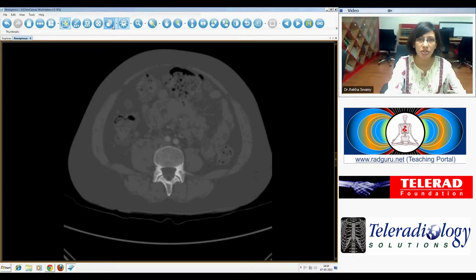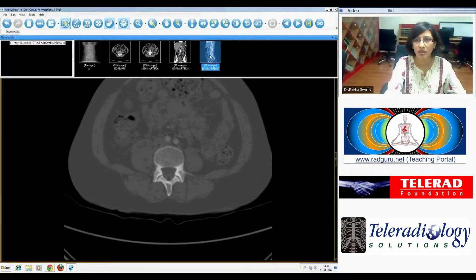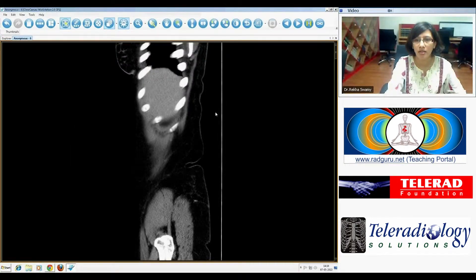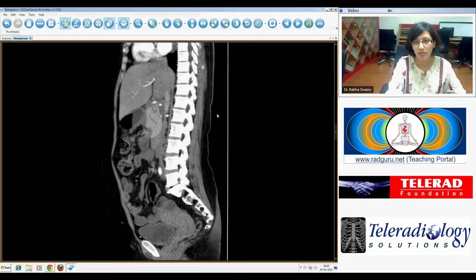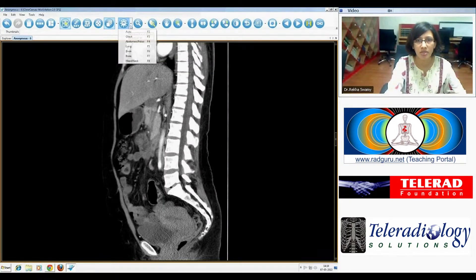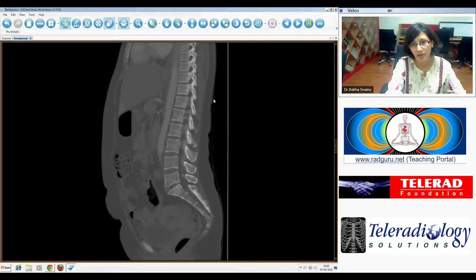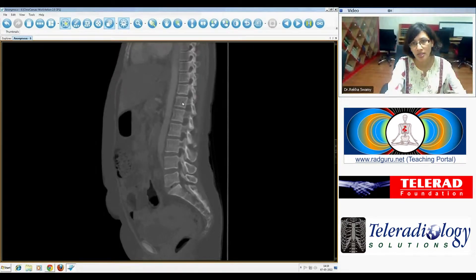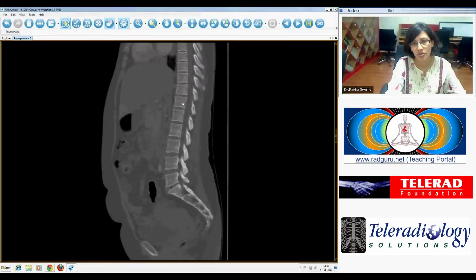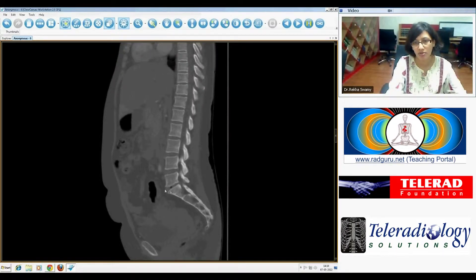Looking at the sagittal reformat, just to make sure we're not missing discitis — changing to bone windows again and looking at the lower thoracic and lumbar vertebrae, we can't actually see any destructive lesions or any evidence of discitis with the individual bones. There is some degenerative disc disease present.